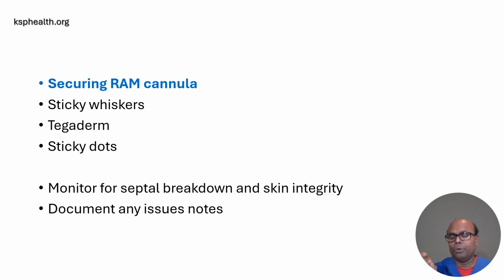Document any issues and notes. It's very important because the people who come on the next shift should be able to look at it and make sure it's not worsening or it's getting better.